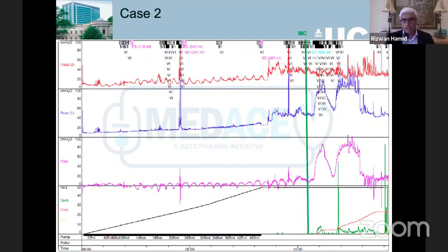And when we hopefully, like Fazal said, do our proper urodynamics course, I will share with you lots of these artifacts and how to mitigate them. But that is why the patient generates a very high pressure and very poor flow, you ignore that. So what is going on?